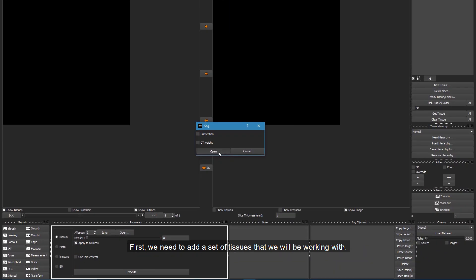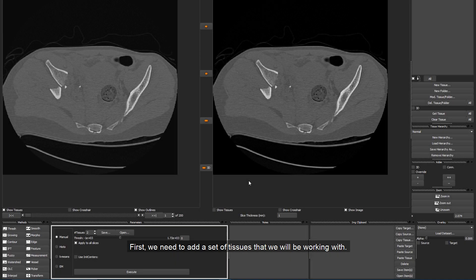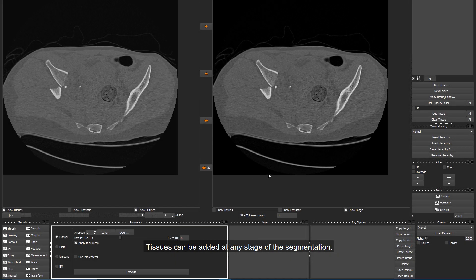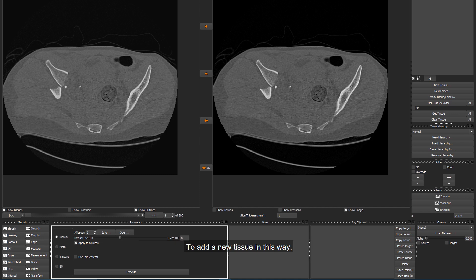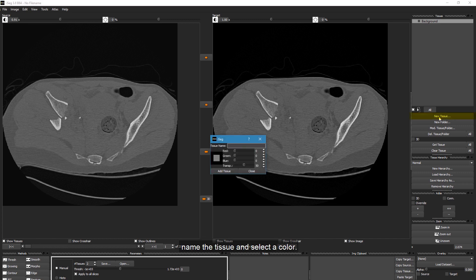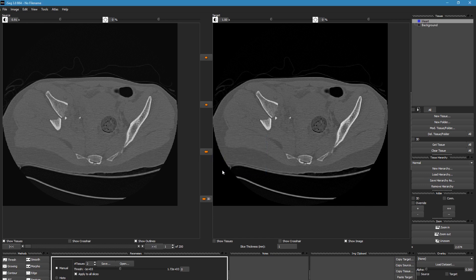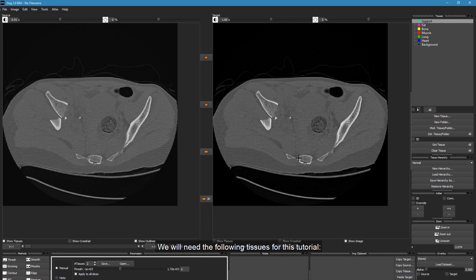First, we need to add a set of tissues that we will be working with. Tissues can be added at any stage of the segmentation. Tissues can be added one by one directly in the Tissue tab. To add a new tissue in this way, click on New Tissue, name the tissue and select a color.